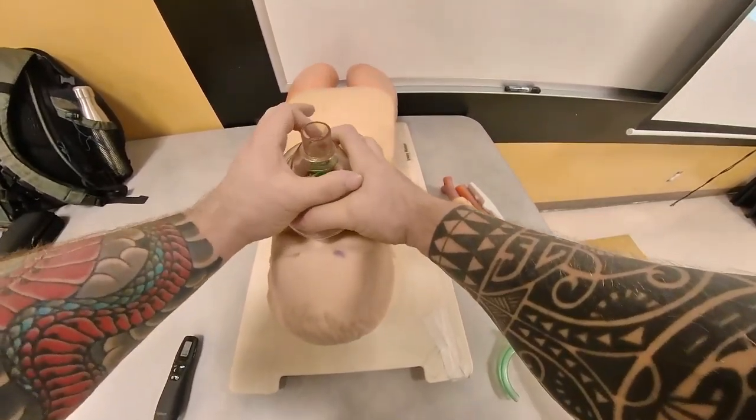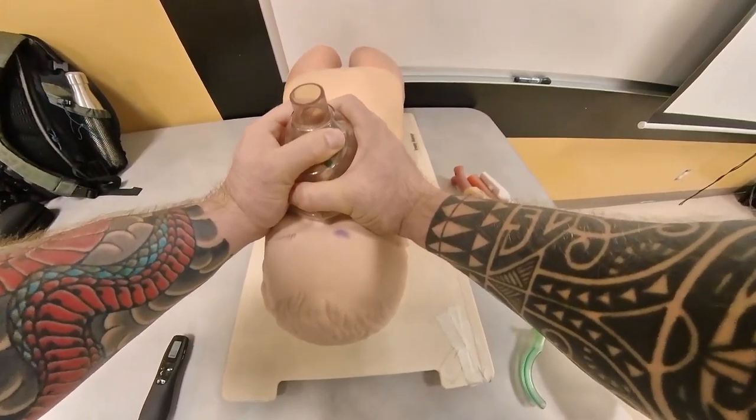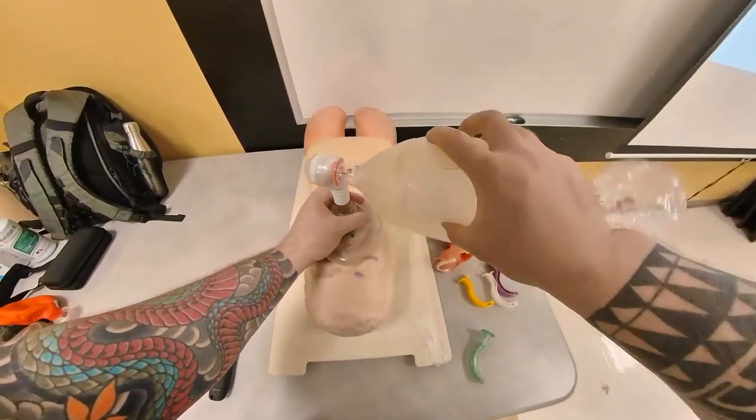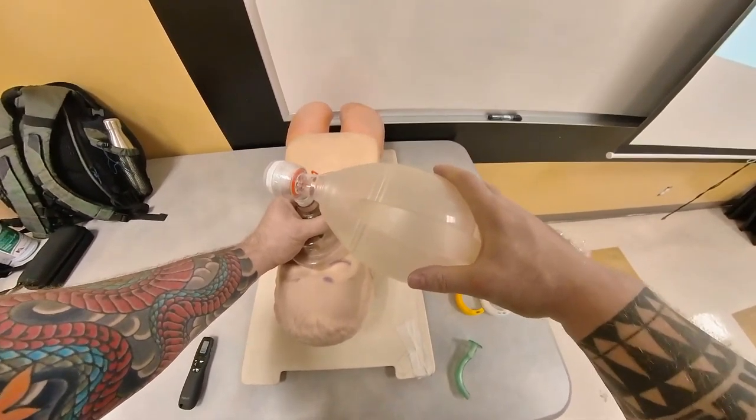You also tend to close the mouth when you squeeze two hands around the mask, and you tend to close the mouth this way as well. An OPA will prevent you from doing that so that you can ventilate the patient.